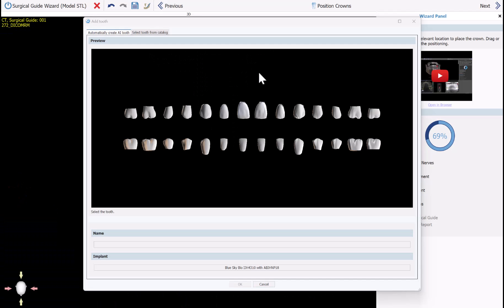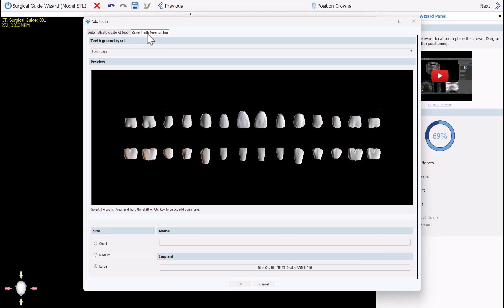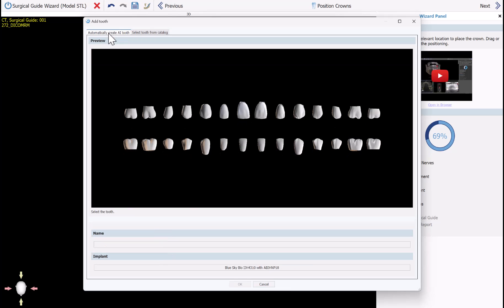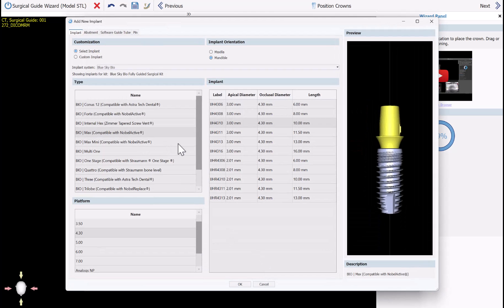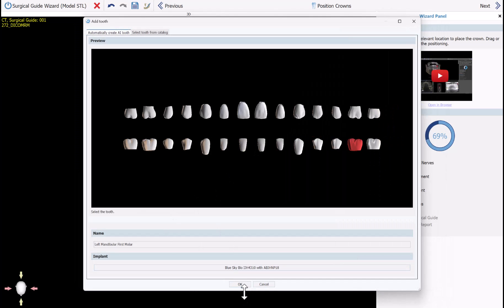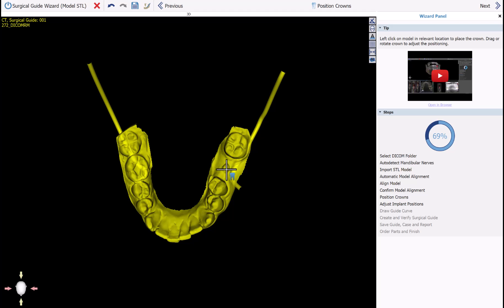At this step the software is prompting us to select the relevant tooth, implant, and abutment. One of the significant updates in this software release is the two tabs at the top. You have Select Tooth from Catalog — the existing option where you use a dropdown to select the tooth set and tooth from a diagram — or you can click Automatically Create AI Tooth, which generates a custom tooth based on your particular data set. You still click the relevant tooth position, select the correct implant and abutment, click OK, and click once where the tooth should be placed.